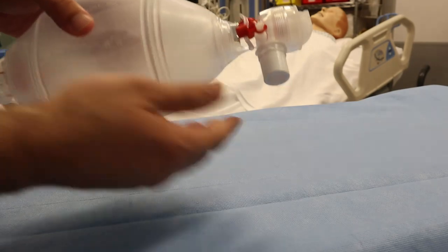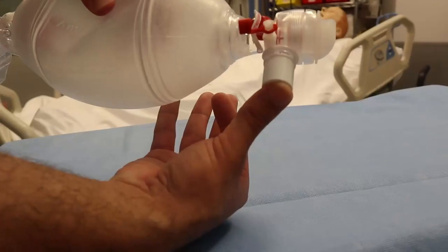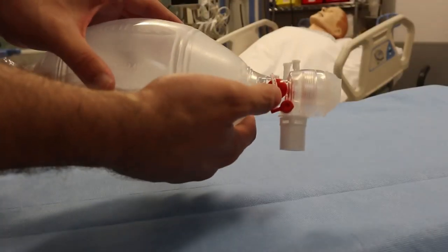If there is leak, it means the Ambo bag is not functioning well. After that you open the medication port. Now you will find there is a sound which is normal, it should be. Now you open the pressure limited valve and you have to hear the flow.